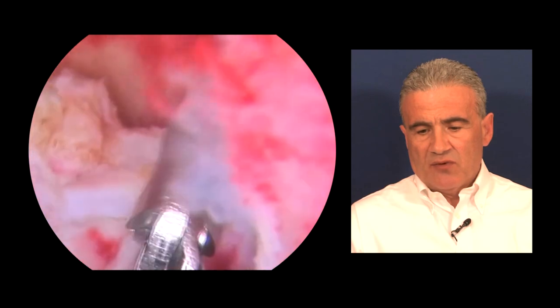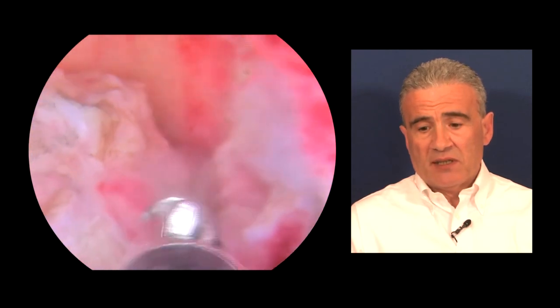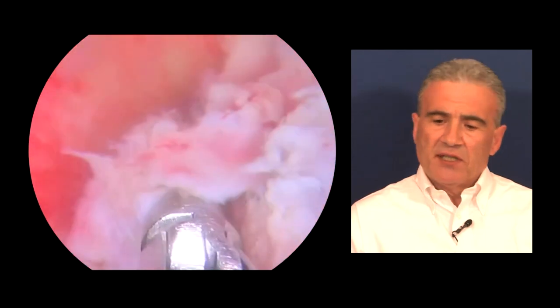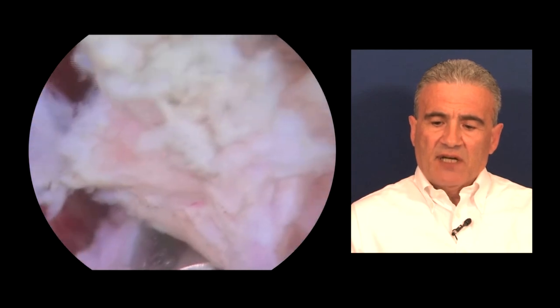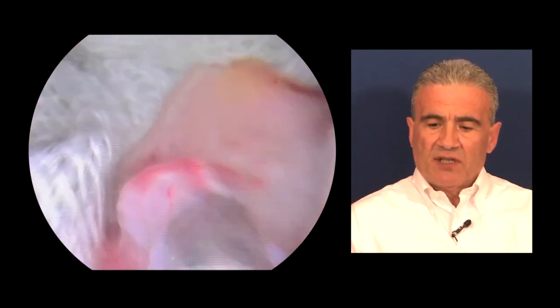We observe how these tractions are being carried out, and we see that the remaining myoma is gradually taken inside the uterine cavity and is then extracted through the cervical channel.